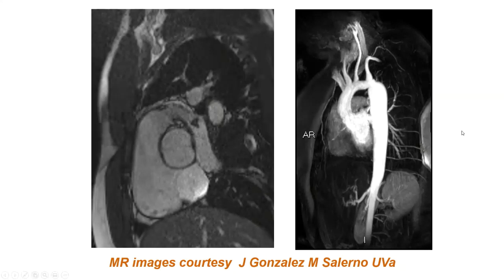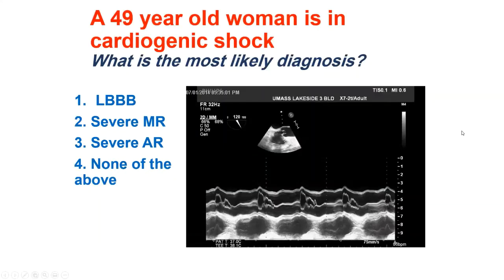Here's an example of coarctation in a different patient. Next case: a 49-year-old woman in the cath lab in cardiogenic shock. This is an M-mode echocardiogram through the aortic valve. The question is: what is the most likely diagnosis? Choices are left bundle branch block, severe mitral regurgitation, severe aortic regurgitation, or none of the above. This envelope is very different from the normal aortic valve parallelogram shape.